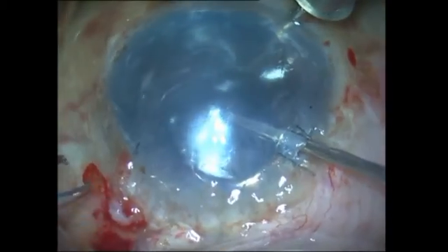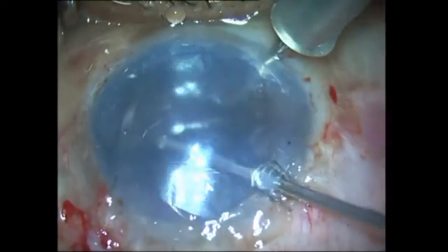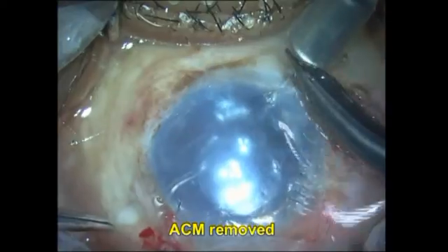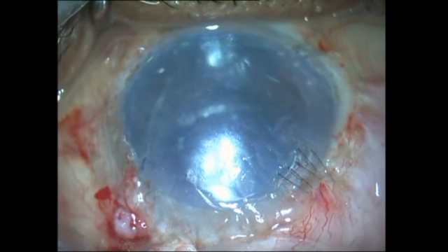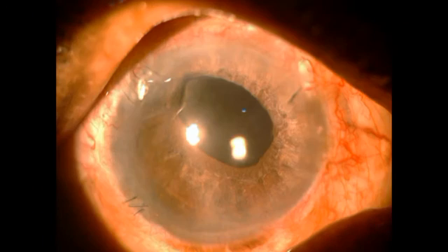I am now performing a vitrectomy for the vitreous strands with continuous air running into the eye. The graft is held up and I am able to clear the vitreous strand in the anterior chamber completely. Of course, the ACM had been turned off from the point of graft insertion, and the graft was unfolded with BSS in the anterior chamber.